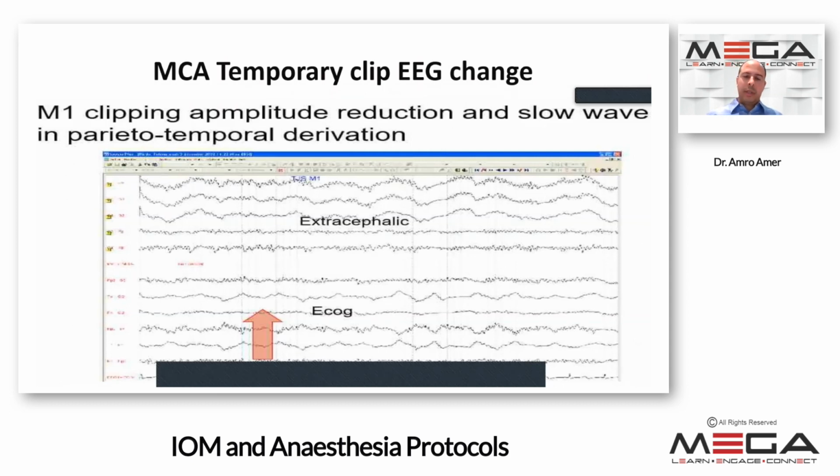We do what's called electrocorticography using an 8x8 strip. Again, usually we put that on the cortex, and we use that in epilepsy surgery, and sometimes we use it in just tumor resection in the front.